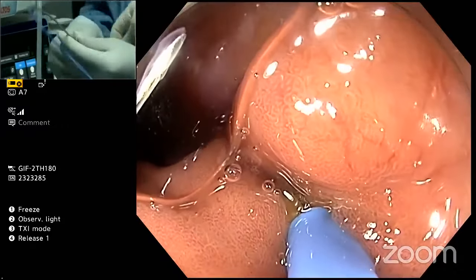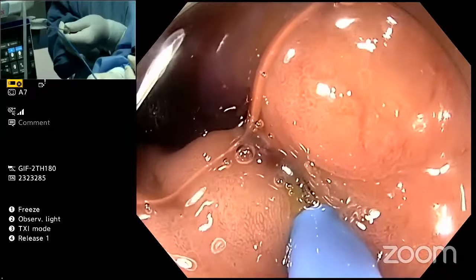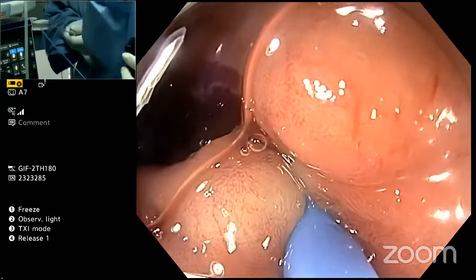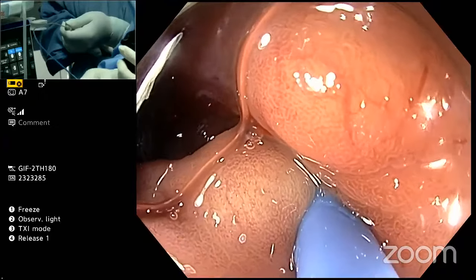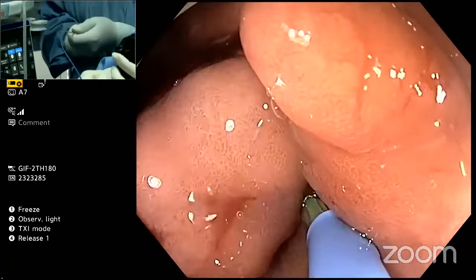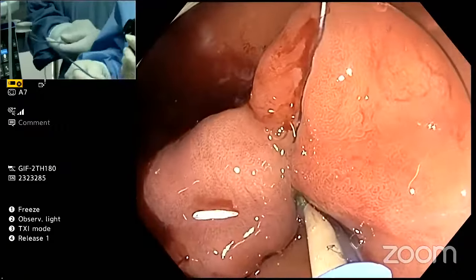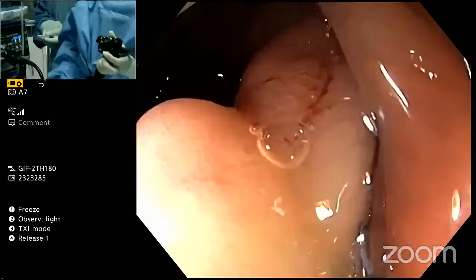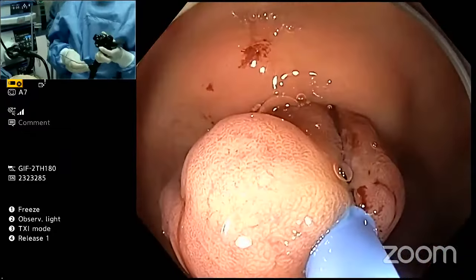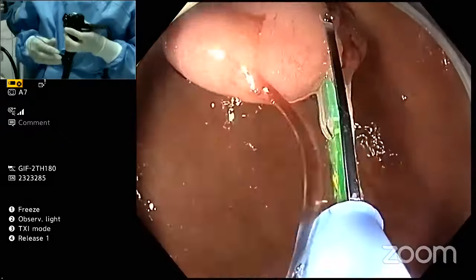Okay, now you're going to grab the thumb ring. You're going to pull it back, which is closing the loop now. Okay, so now the loop closes and it springs off of the snare, right? It detaches from the lugs of the snare. Okay, and once it's closed, now you're going to open the snare again, and then I just detach this and pull it off. And is the snare open? There it is. It's open.